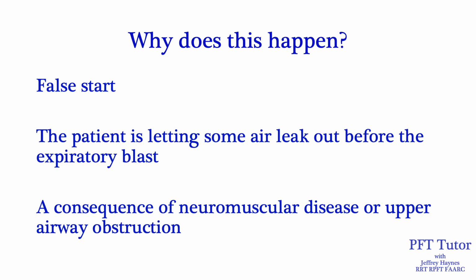performing forced exhalation. It is important to note that even with good effort and cooperation, this may occur in patients with neuromuscular disease or upper airway obstruction simply because they're not able to perform a strong forced exhalation.